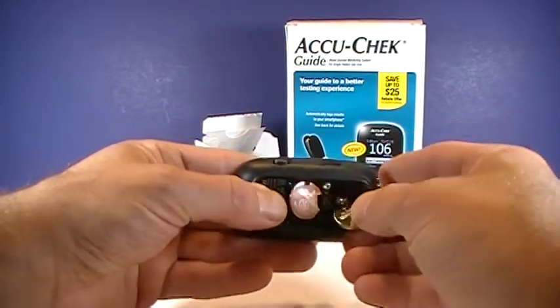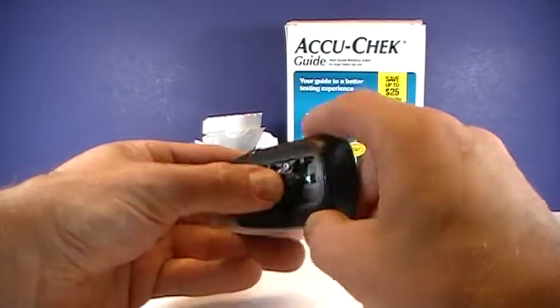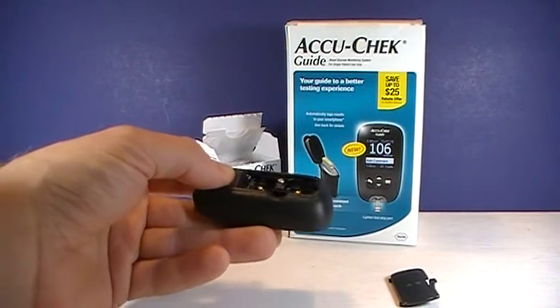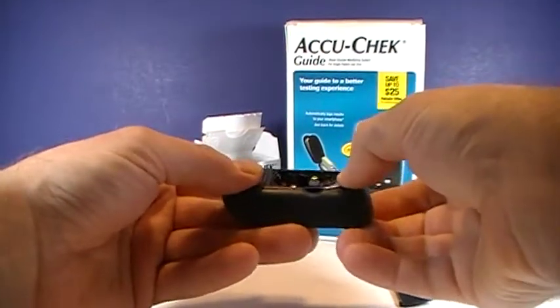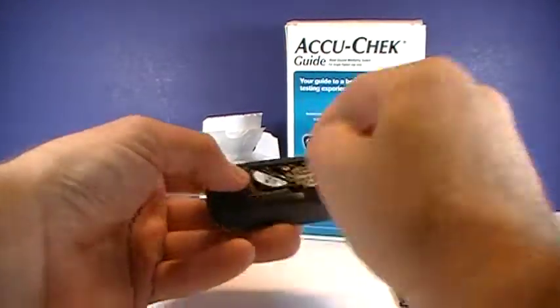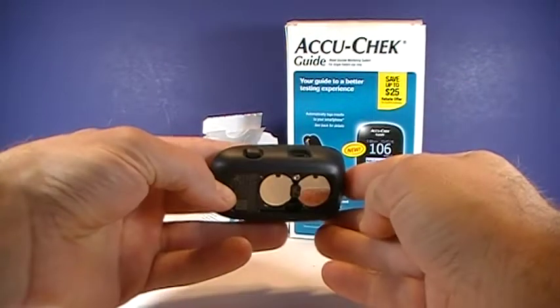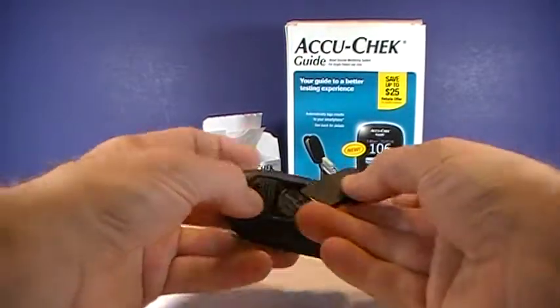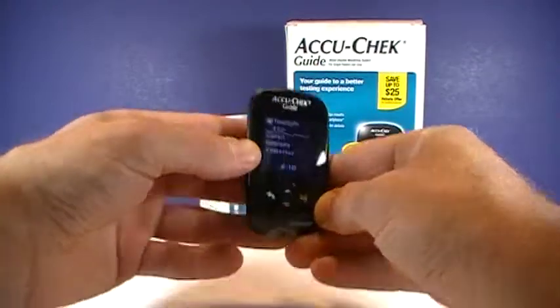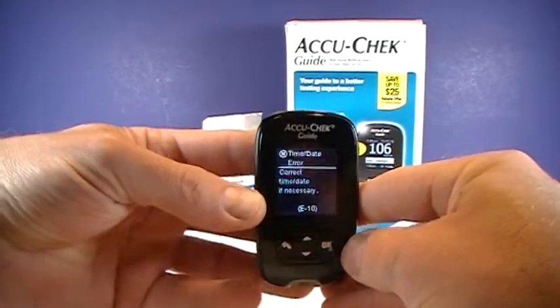You push that, and the batteries will come out. So you can replace new batteries the same way, put those in, there you go. Replace the door, and at that time it may indicate that time could be incorrect.